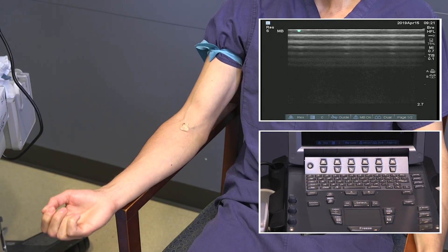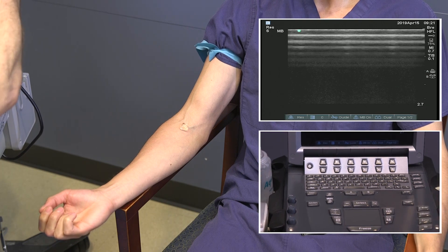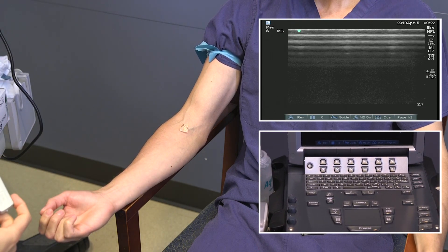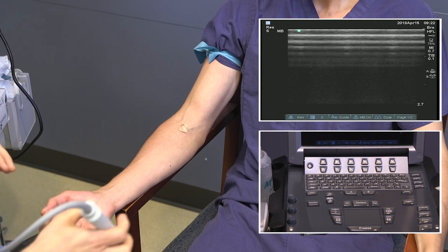We'll apply a thin amount of gel to the arm by painting it up and down. It's really important to orient the probe to prevent confusion during the vessel mapping.